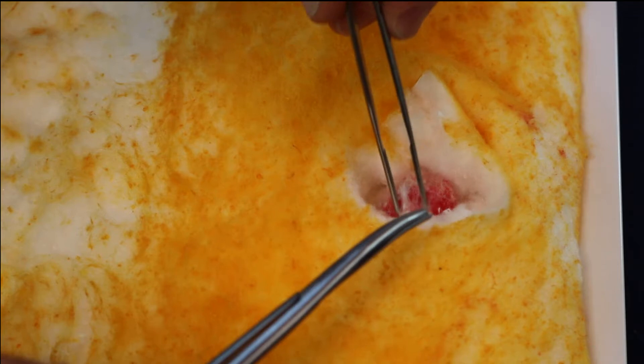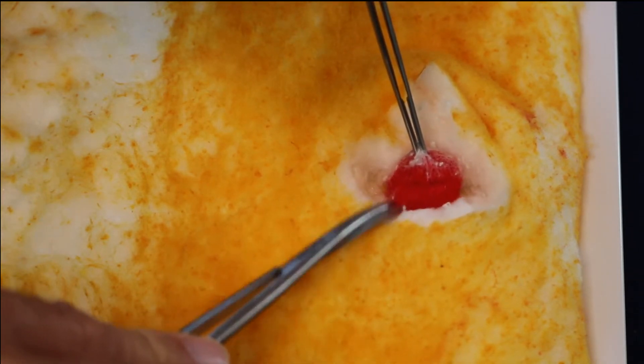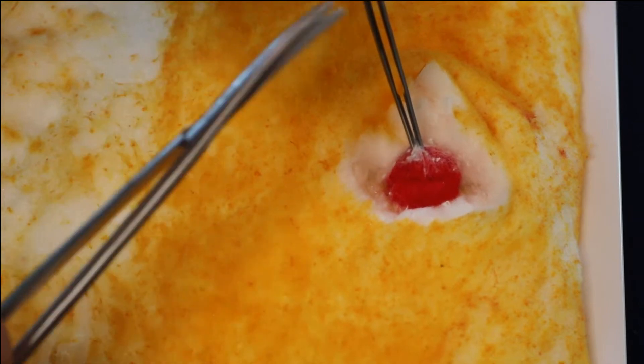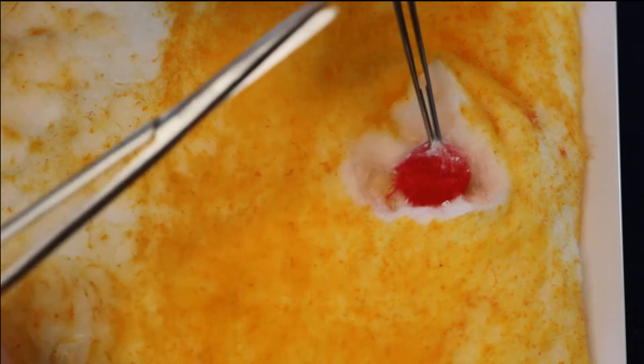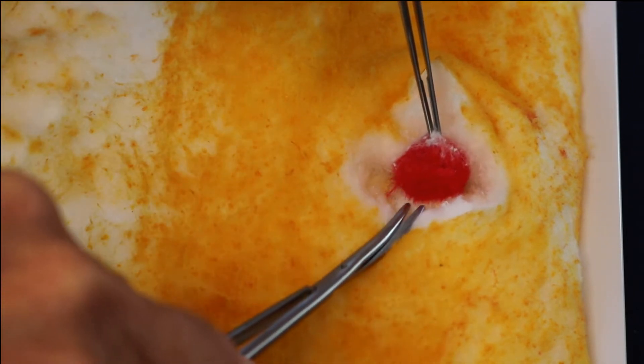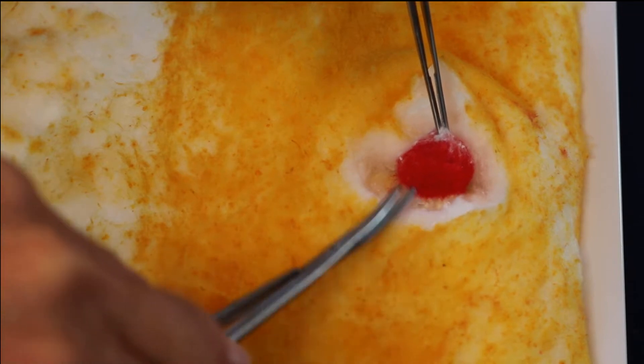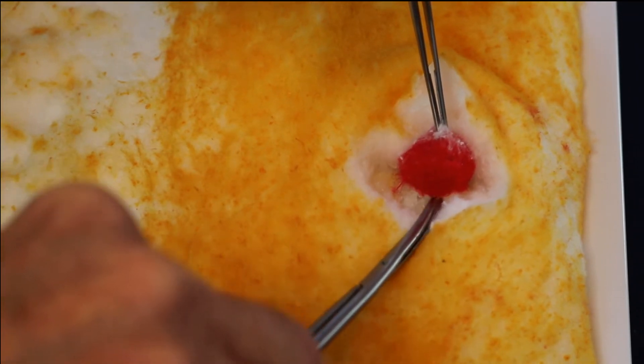The direction of the curve of your scissors for this exercise is a bit controversial, but you will probably gain purchase of tissue better with the curve facing down. However, as you come around the back of the mass, you will note that we have changed the direction of the scissors to allow circumferential dissection in poorly visualized areas.